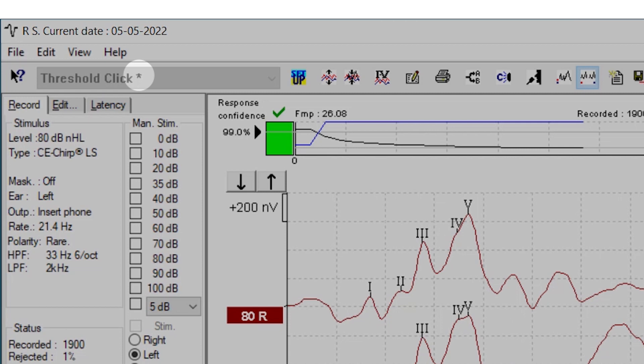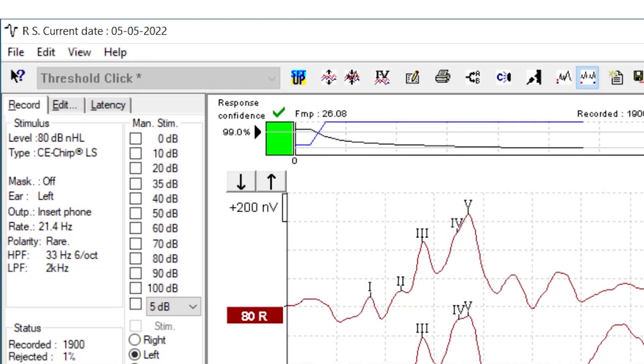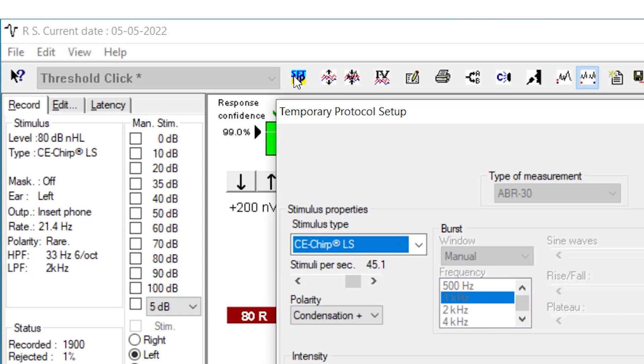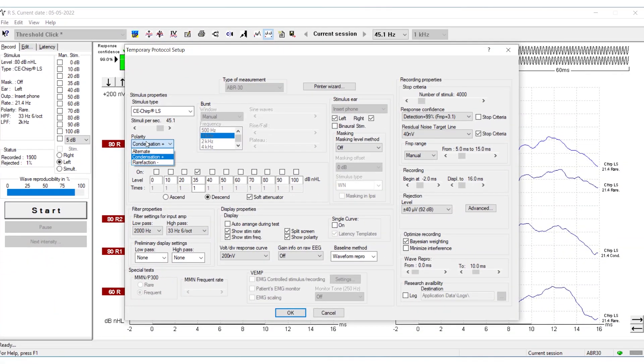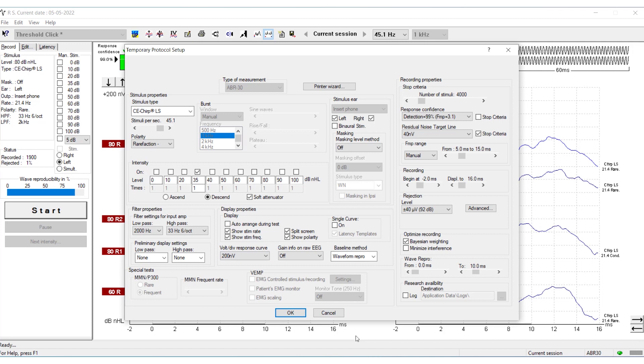If you want to change back to rarefaction, click Setup again. When you save this measurement and close the Eclipse, the polarity will be set back to rarefaction.